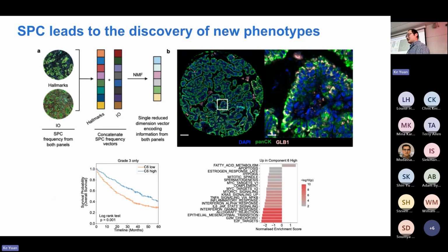So GLB1 was selected as a cell senescence marker. They basically used it with the assumption that patients with a lot of GLB1 should do really badly in terms of survival. But what we find is that in images where those GLB1 are very close to the periphery of the cell, patients with those phenotypes actually do better.